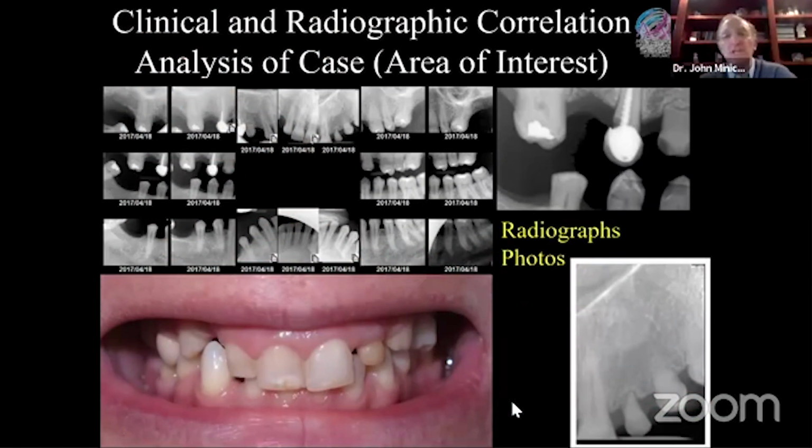So when I first looked at the case for this patient that we've been discussing, Kat, I thought about that. Okay, yeah, we could just remove all of your teeth on the top and the bottom and give you fixed detachable uppers and lowers. But some of the concerns I had with that is the amount of reduction I would need to do for this particular patient, and also the health of these teeth. She's 43 and these teeth are not unhealthy. Her periodontal condition is the opposite of her husband's.